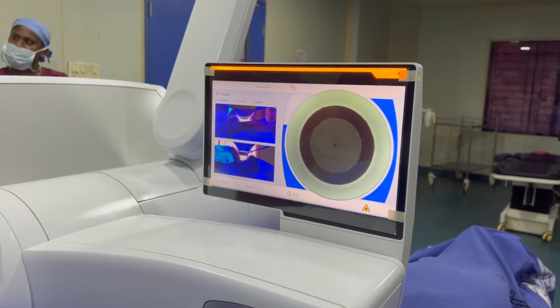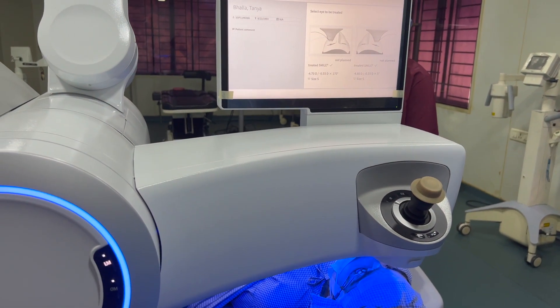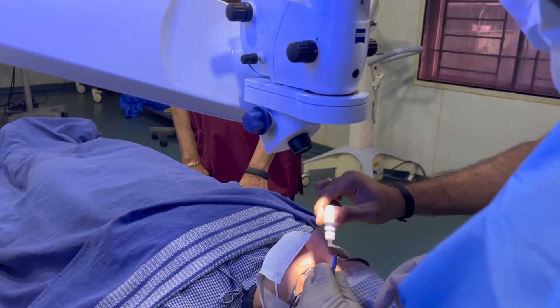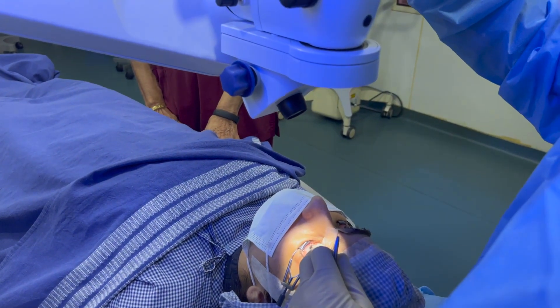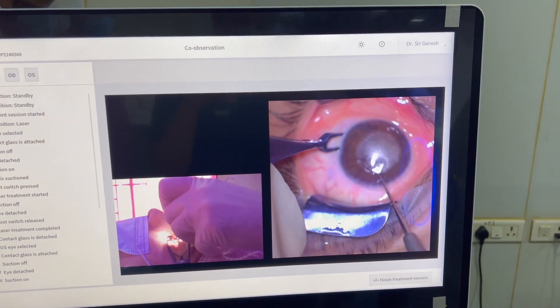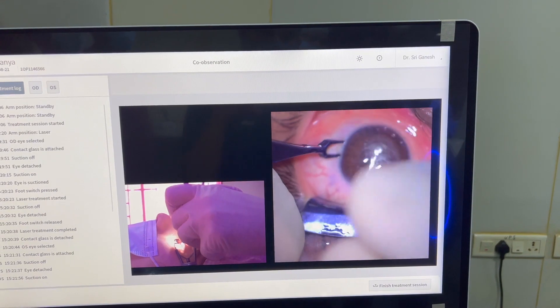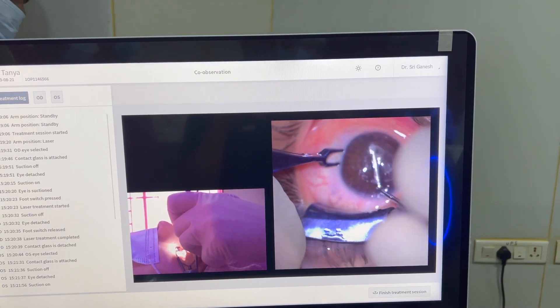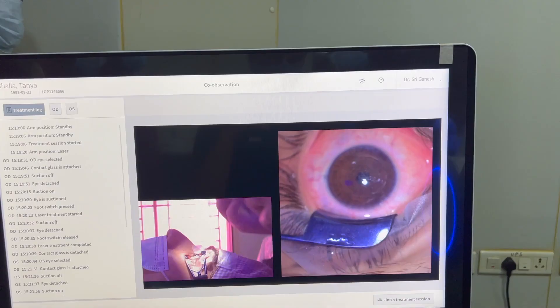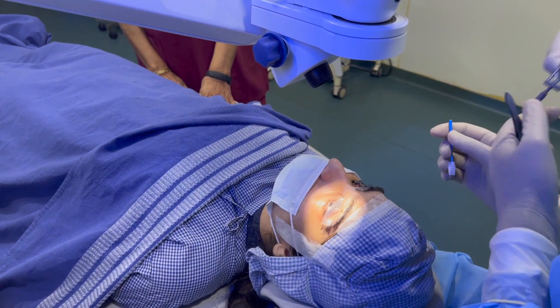I fire the laser to complete the treatment. Once done, I remove the patient interface, then bring down the microscope arm. After lifting the laser arm, I adjust the microscope and perform the lenticule extraction for the left eye.